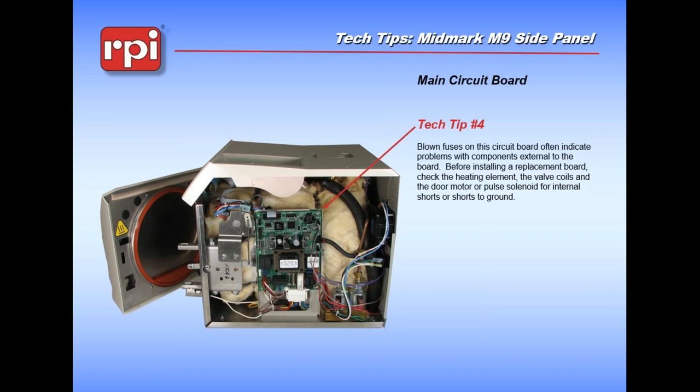Blown fuses. We all like to hope that when we replace a fuse on something it's going to fix our problem. Unfortunately, more times than not, if you just put fuses on these boards it doesn't fix anything - all it does is let you blow more fuses. The things you want to check are going to be external to the boards: the coils on the valves, the drive motor, the temperature probe, the things that connect to the board. But unfortunately, more times than not, the reason the fuses blow is because of bad relays, and there's nothing you can do about it on the next stage board. So if you wind up looking at a machine with blown fuses, odds are you've probably looked at it before.